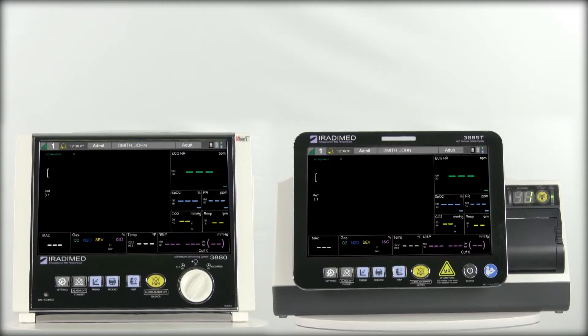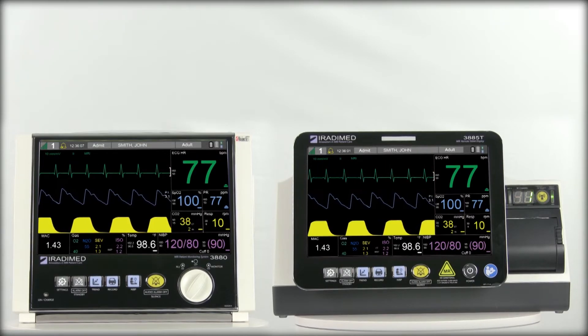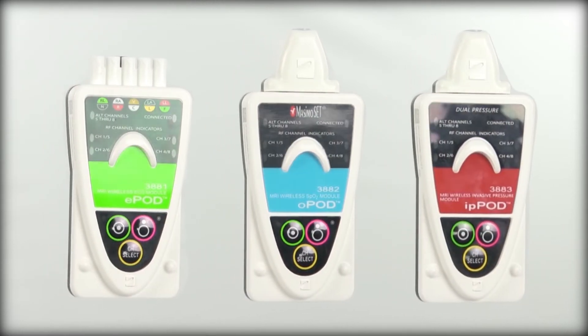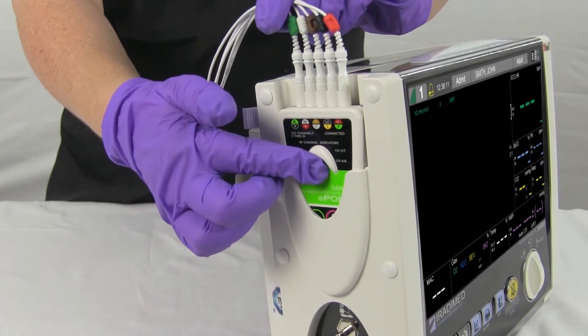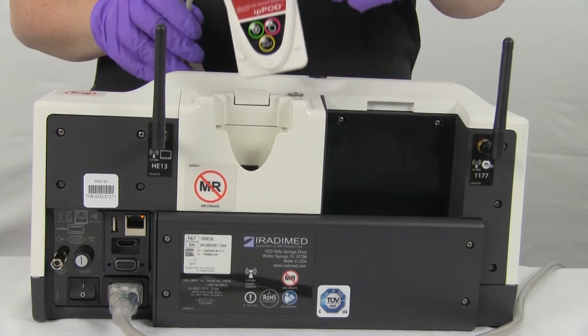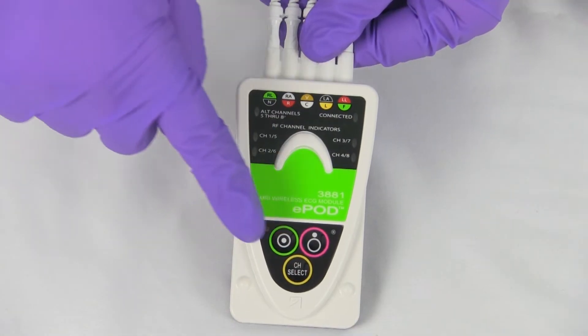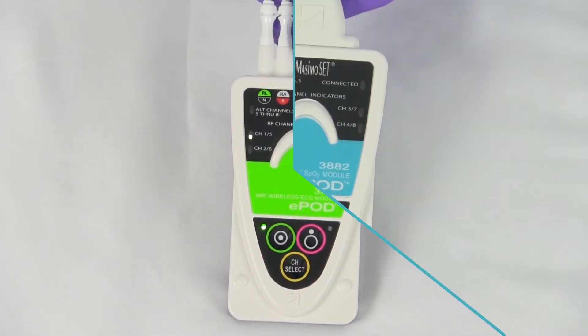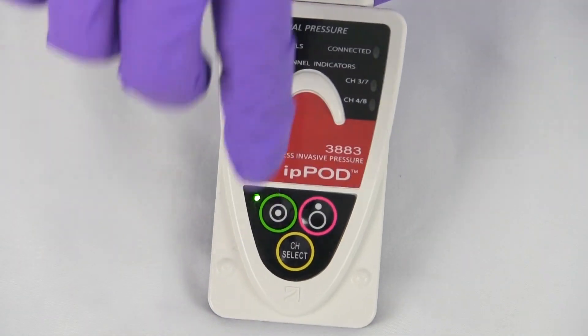The wireless remote's display is identical to that of the monitor. To power on the wireless ECG, SpO2, and invasive blood pressure pods, first remove the pods from the charging dock on the monitor or optional base station dock. Gently press the green button on the top left corner. The pod will power on instantly. Repeat the process for each remaining pod to be used for this patient.